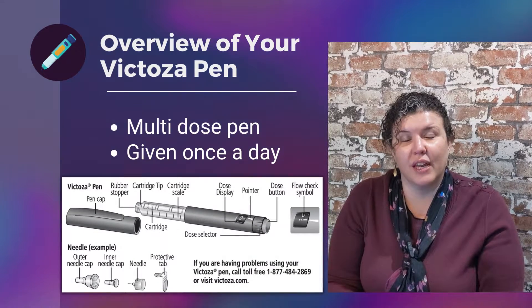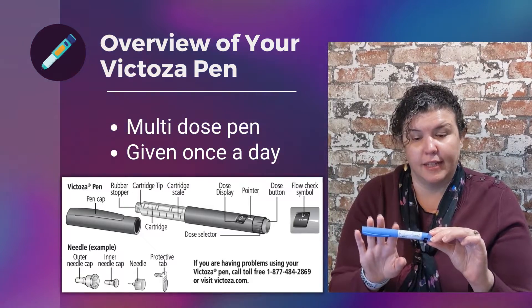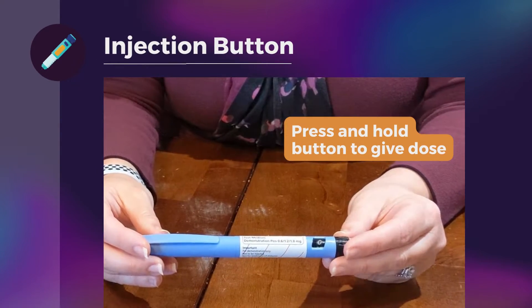Hello, and I'd like to give you an overview of the Victoza pen. This pen is a multi-dose pen that is given once a day, so all doses are contained within this one pen. I'd like to move on to giving you an idea of the components of the pen.